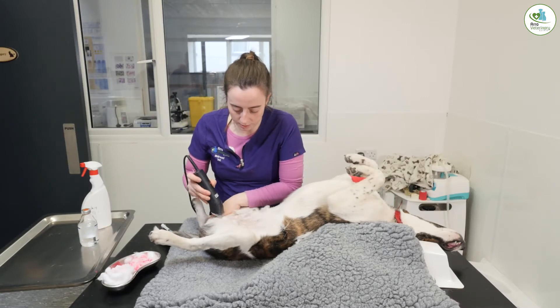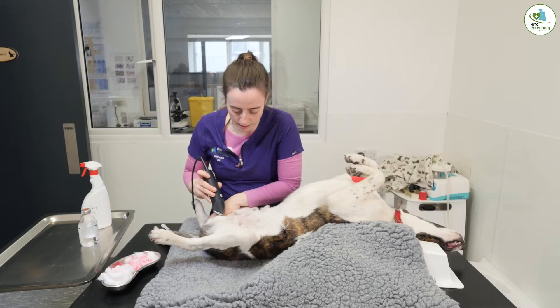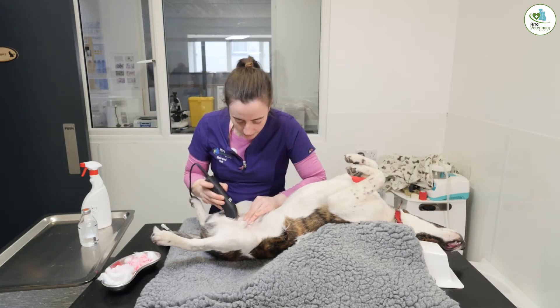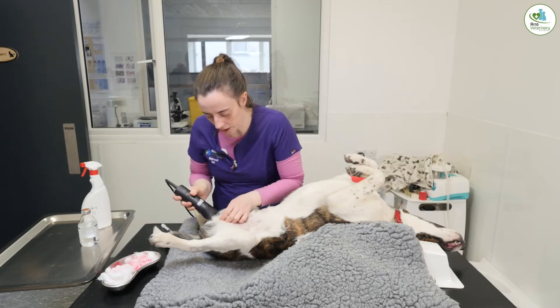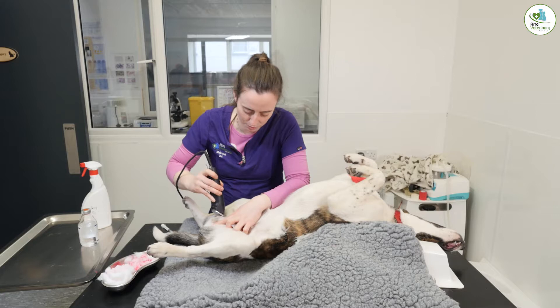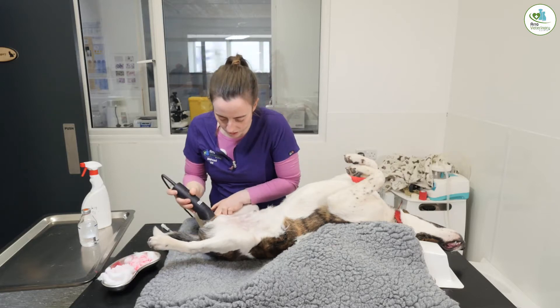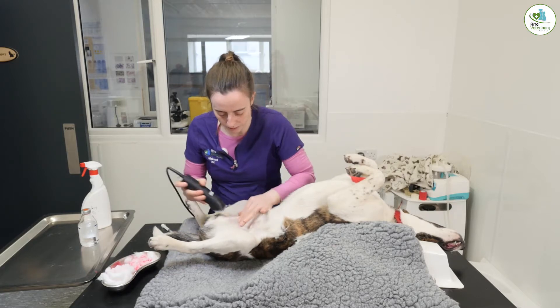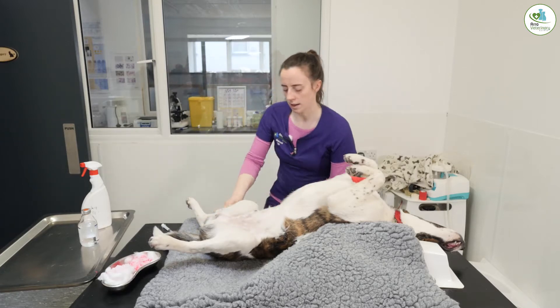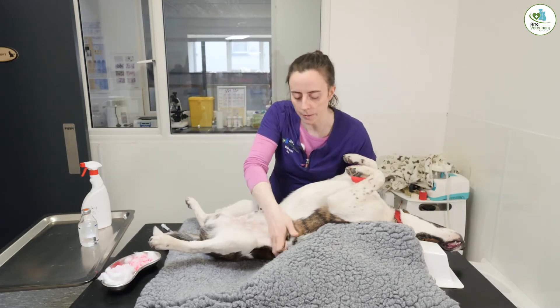Always go very gently when you're clipping — nice and slowly — and don't leave any red marks on it. Try not to clip too much hair off the testicles because it can make them really itchy, so just clip the front area that will be near your wound. That's everything for that, and the next step is to give them a clean.